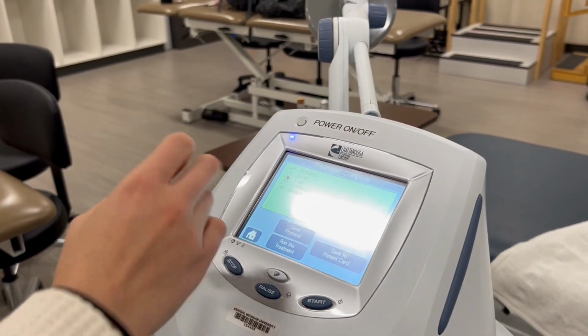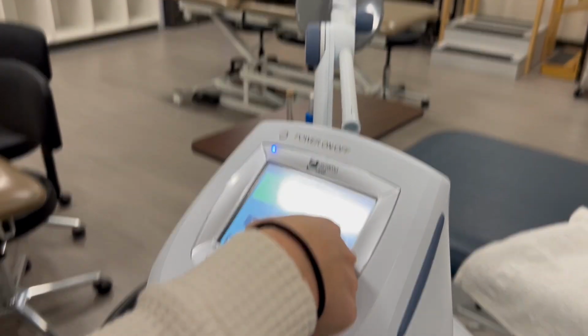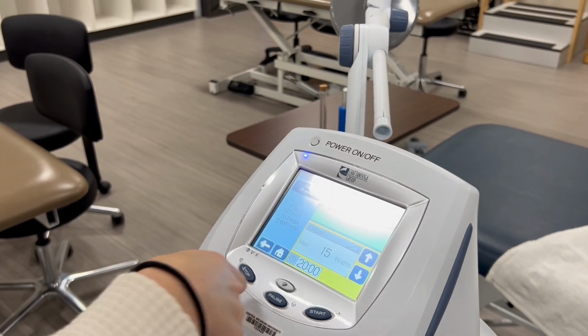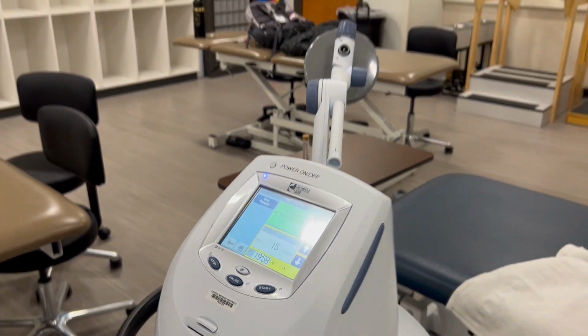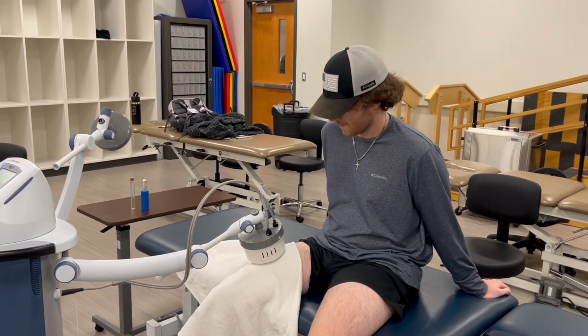In this video, we are going to be using the average watts at 15 for a dosage level of 2 to achieve mild heat sensation. We're using a continuous shortwave diathermy for this, set at 20 minutes.